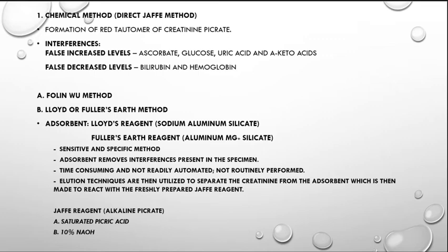Okay, so your chemical method or direct Jaffe method is a non-specific method. It has the ability to measure creatinine-like analytes, for example your uric acid, these interferences here. So, to remove these interferences, we usually add Lloyd's reagent.